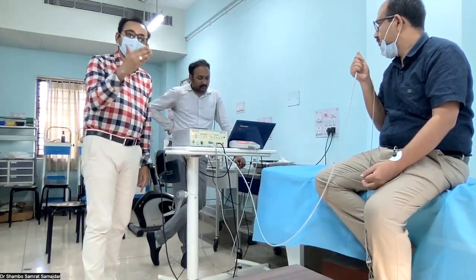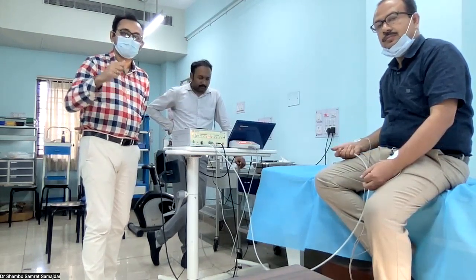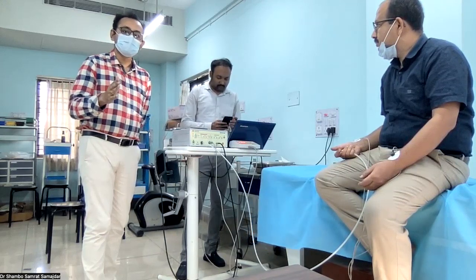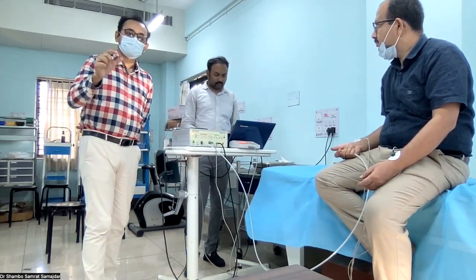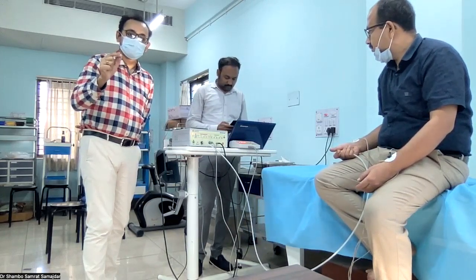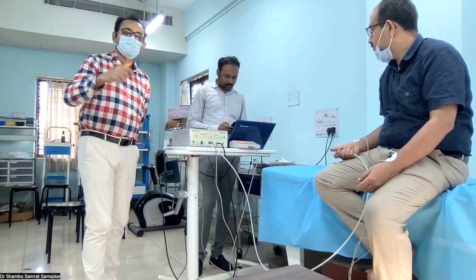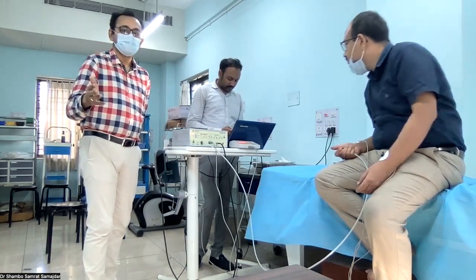Then also followed by that, the ECG should be done continuously, because we also need to check the 15th beat post Valsalva, 15th beat RR interval and 30th beat RR interval to get that ratio. Also, what is Valsalva ratio? Valsalva ratio means during Valsalva, as the heart rate increases, the RR interval will be going down. So we need to take the minimum RR interval from that 15-second duration, and also get the maximum RR interval, so that we can calculate the ratio of maximum RR interval and minimum RR interval, and that ratio should be more than 1.2.